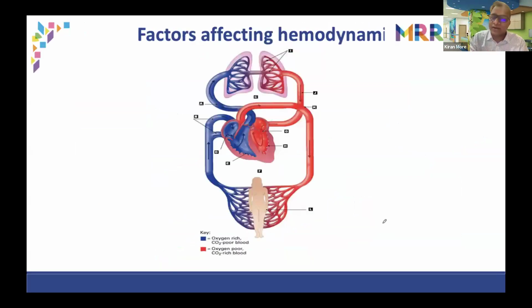So that's why we say for any hemodynamic status assessment, you need three things which need to be normal. And these are the things which we can assess on the echo, and that's nothing but your echo indices. So one is having enough intravascular volume. So what is the preload? You need to know what the preload is like, what the IVC filling is like. And your preload will be less in hypovolemic shock, placental abruption, and sometimes with sepsis, there is third spacing, then the baby will be hypovolemic, with decreased preload, decreased SVR.